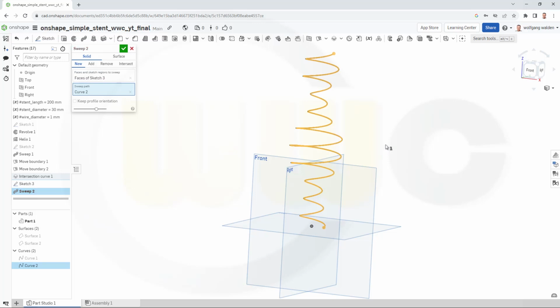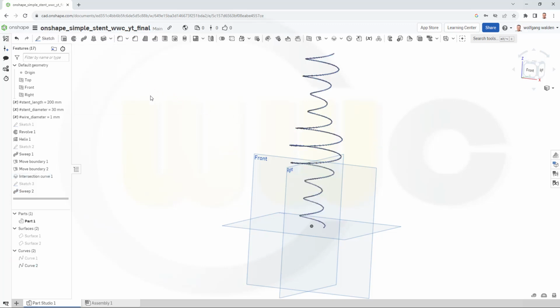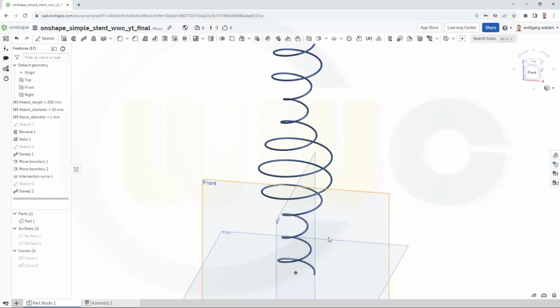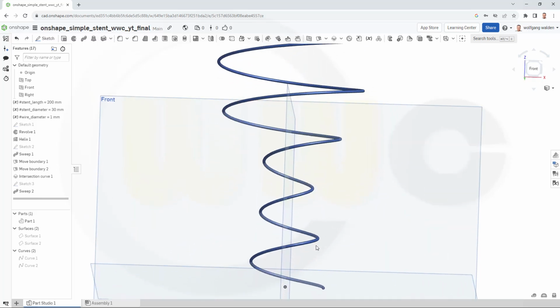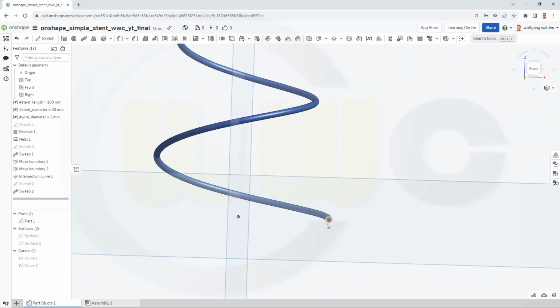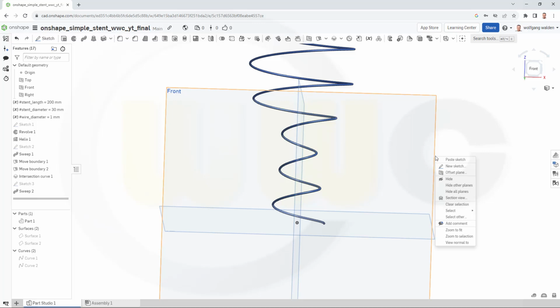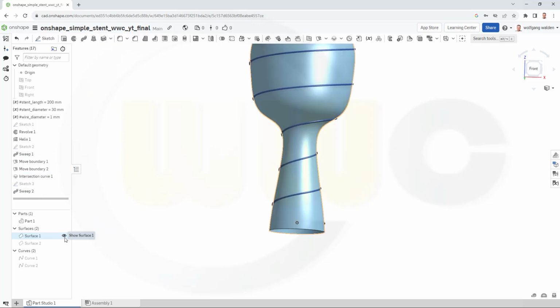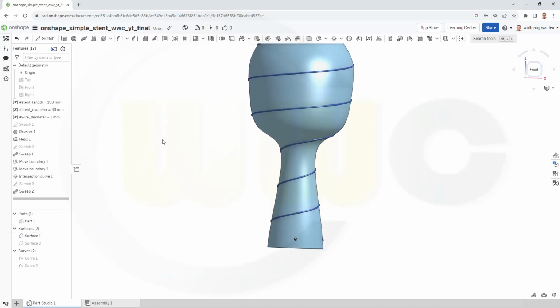Let's see if we can go around to the top up there and confirm, and we could hide that intersection curve. Nice. Now I want to shape that wire a little bit. So here, let's hide all planes. And I need 2 offset surfaces from the revolved surface. So where is it? That's this one here. Yeah. And I need an offset surface.